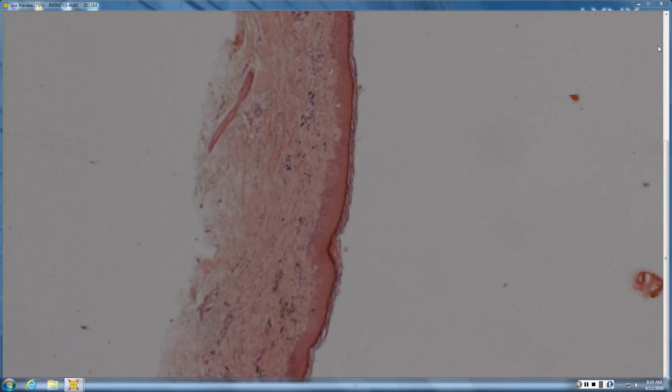What if I told you a benign nevus had been shaved here about 3 months ago? I'd like to see the original. Yeah, you want to see the original. Could it be recurrent nevus? Well, if this is scar, it could be recurrent nevus, right? How are you going to tell the difference? So I'll punt this one to the fellows.